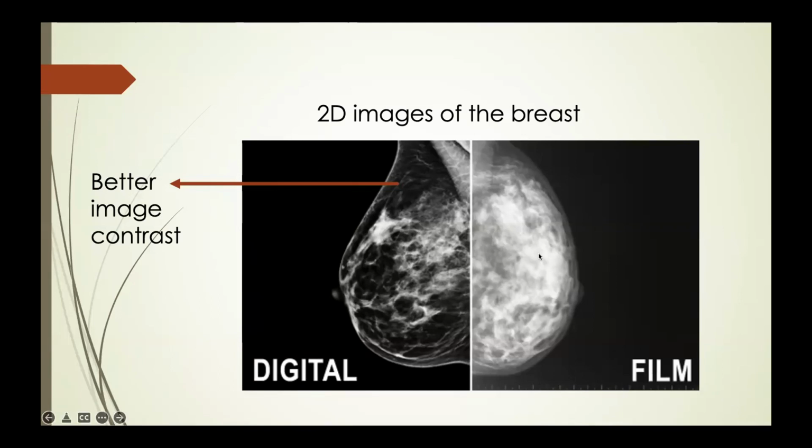Before, just looking at this film, you need to be somebody highly trained. Even me looking at it now, I can't even tell if there's cancer in this breast or not. But the digital one makes it very easy to spot blobs, calcifications, and other anomalies.